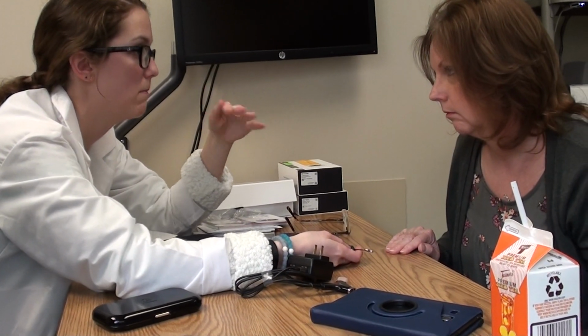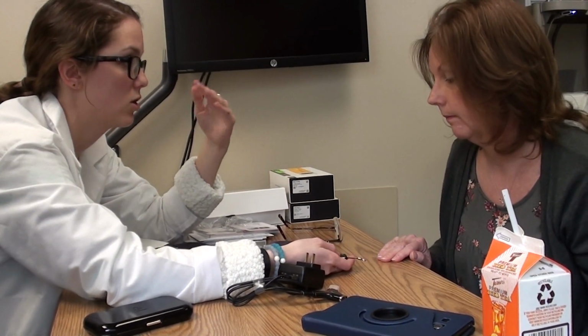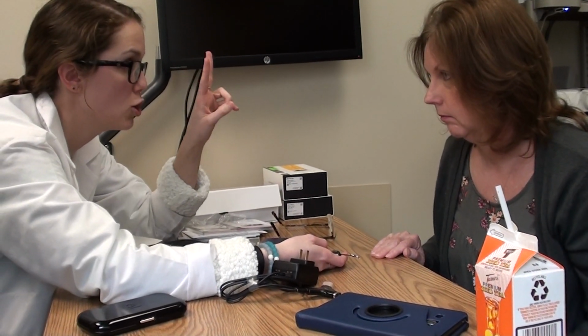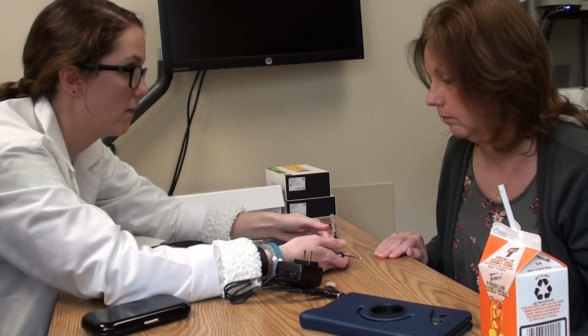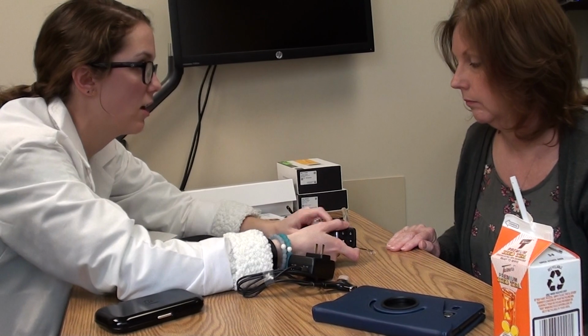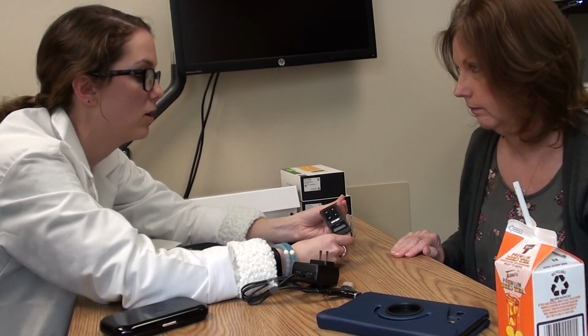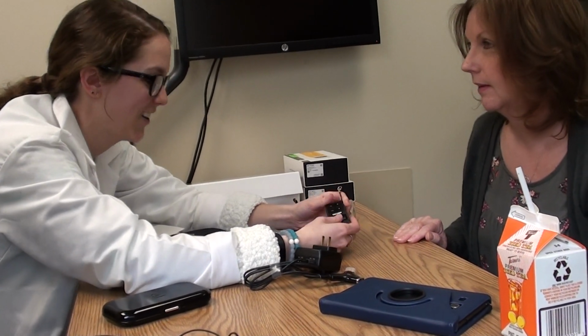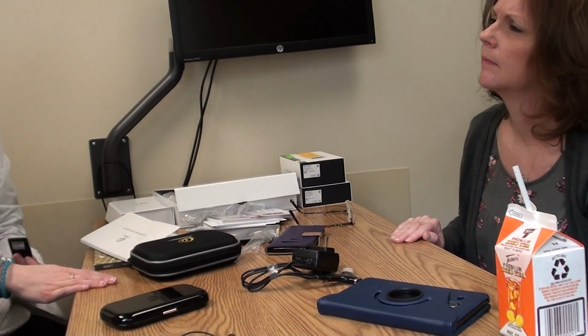And this is where we mapped it to today. So this is where you'll start out wearing it. And then if you need it louder, you can go to program 2, or you can make adjustments with the volume, okay? And then when you're done with it, you can turn it off. And then you can hook it on your keychain or just carry it with you, okay? I don't want you to wear program 4 unless you feel like you have to. Program 1 is already pretty soft.